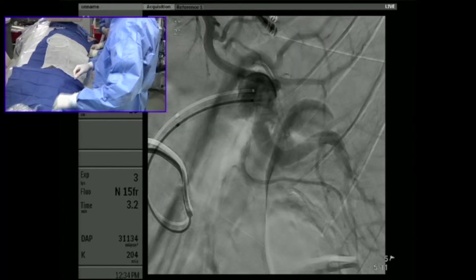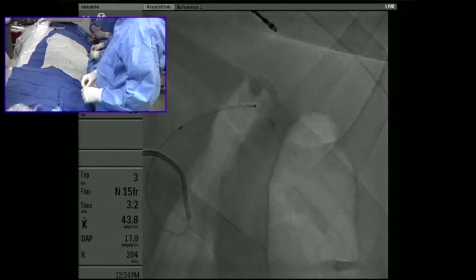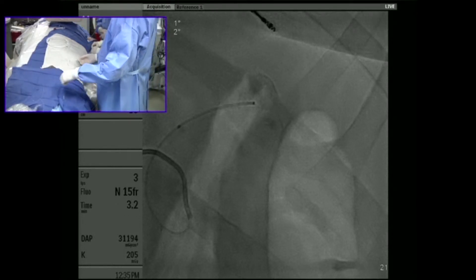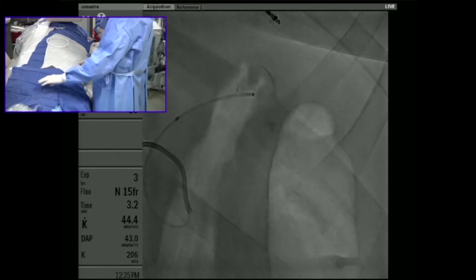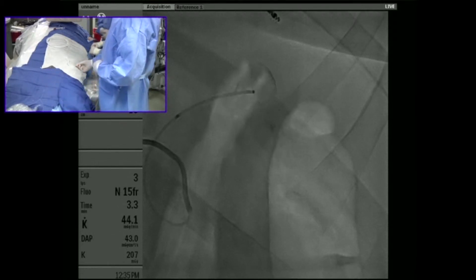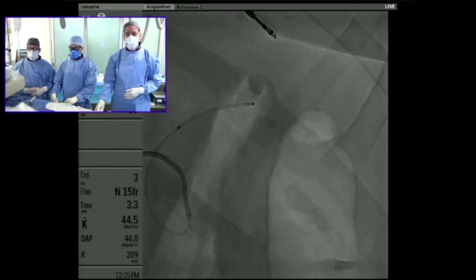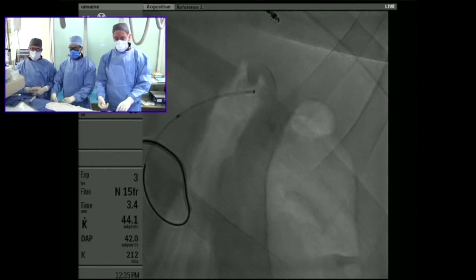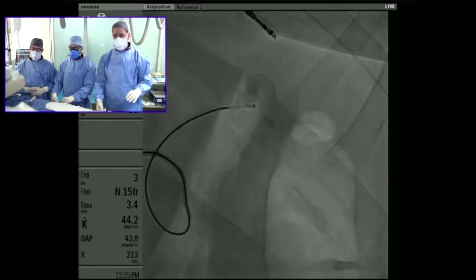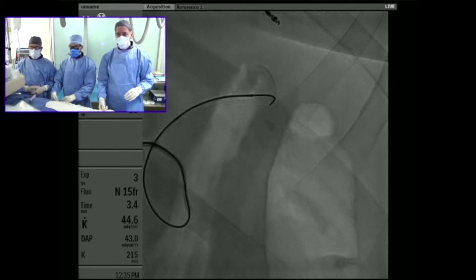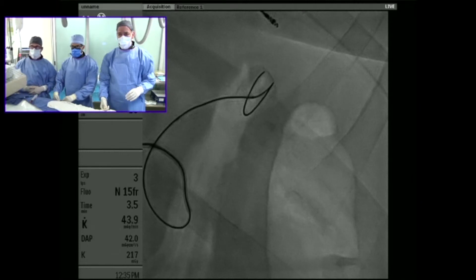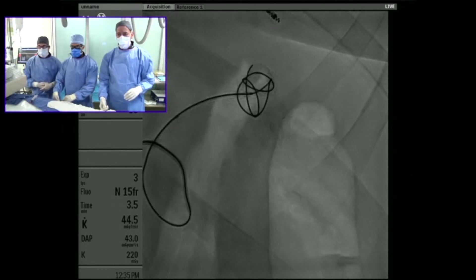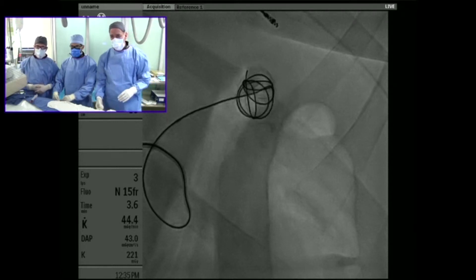The first coil is a framing coil; the size of this particular coil is 20 by 50. As you see it going through the microcatheter, it's going to create somewhat of a cage for the rest of our coils — this is what we would typically do as the first coil, as it gives us a lot of support. In some situations we would coil the outflow first, but here we are coiling the aneurysm sac directly.